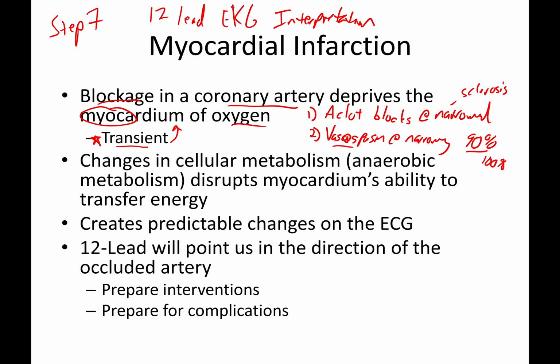So that's also one of the reasons why stress tests work. Get them there, get the heart stressing, get it moving, tightens things down, stresses an already narrowed vessel. It can, for the period of activity, create changes in an EKG, or in this case the radionucleotides, changes in uptake, oxygenation, and metabolism that show up.